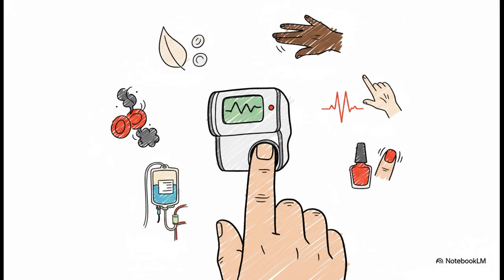Pulse oximetry has absolutely revolutionized patient safety, but we must never ever forget its limitations. This list covers 10 common pitfalls. It's particularly important that we're all aware of the risk of occult hypoxemia in patients with darker skin pigmentation, where the device may overestimate the true saturation, low perfusion states, motion, IV dyes like methylene blue, and of course the dyshemoglobinemias we just discussed. They can all lead to inaccurate readings. The take-home message is always correlate the number on the screen with your clinical assessment of the patient.